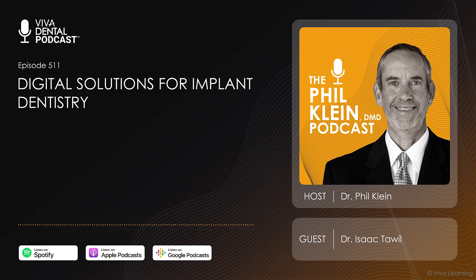Now what we can do is have a plan, print the surgical guide, same day, next day. It might take us a few days to actually make our plan. And then we can actually have a set of teeth that we have a design for, but we don't utilize until after we place the implants. Once we place the implants, we then rescan the mouth, compare it to our original scan, and then import that design and align it with where our current implants are.